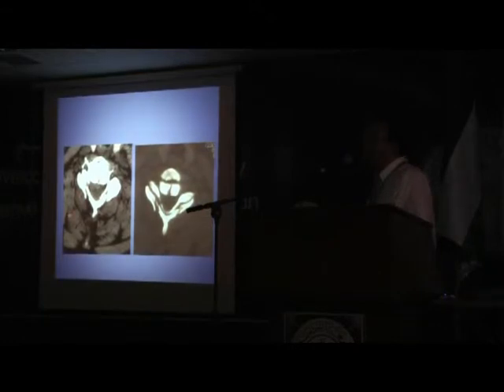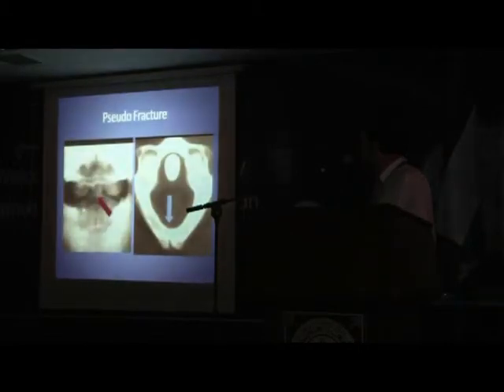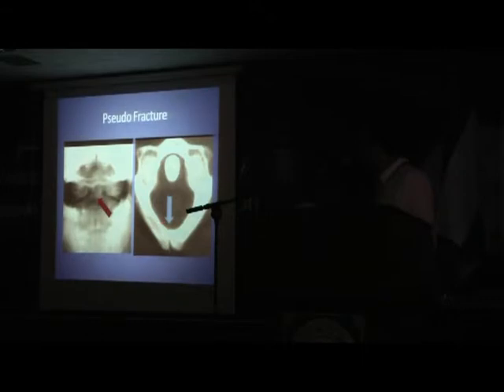The importance of windowing. When you window images in CT scan, on the soft tissue windows, you get an idea there's some pathology here, but when you go to bone windows, you see all these comminuted fractures posteriorly and anteriorly. There's things that look like pathology, but they're not pathology. They're pseudopathology. When you look at the dens process on an X-ray, sometimes you see what looks like a fracture line. And that's actually a congenital variant where the posterior arch of C1 is not completely fused.